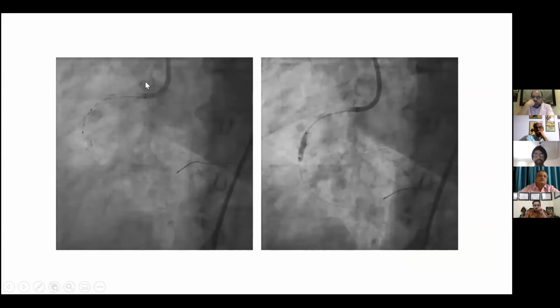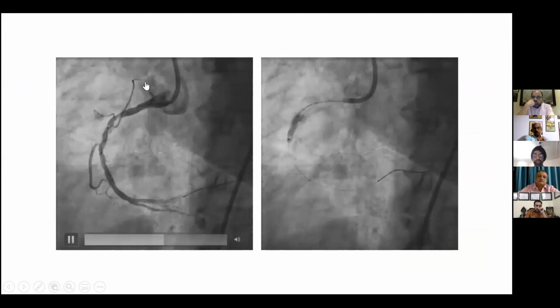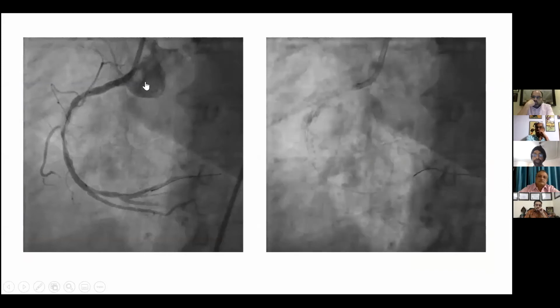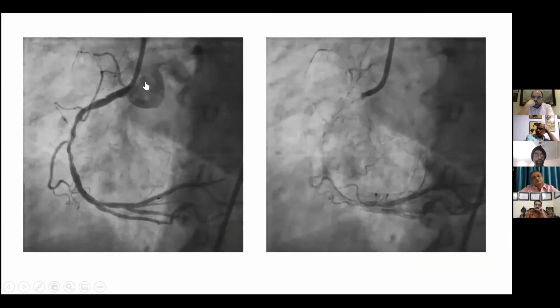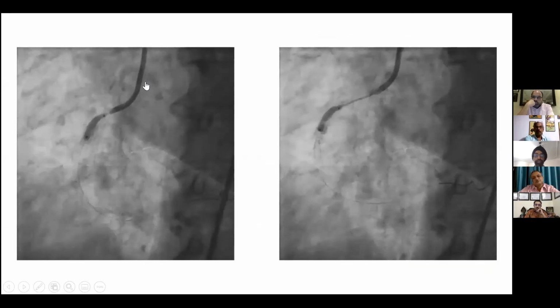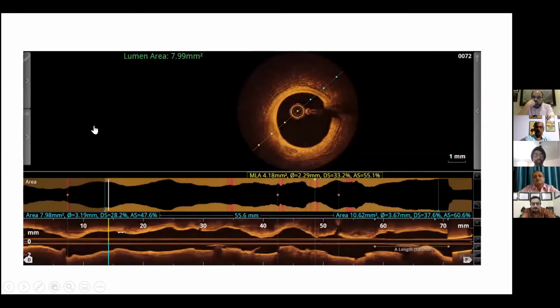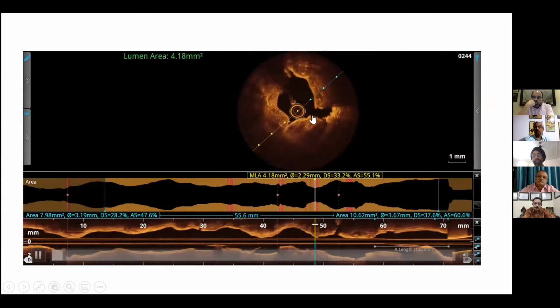After this, this is an IVL balloon. So lithotripsy was done in this particular patient. You can see the expansion of the lithotripsy balloon. This is a 3.5 balloon, which took some efforts to get in, but it did go in. And once we did the entire vessel with lithotripsy, we checked the result. And you see the cracks. This is the crack in the calcium, this part. You see a crack in the calcium with this lithotripsy balloon.